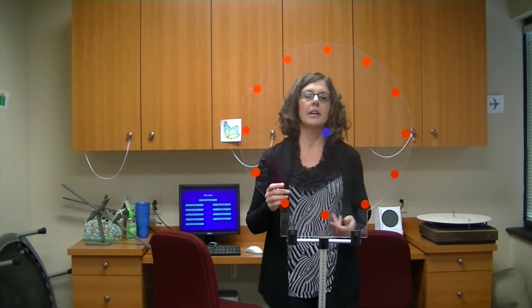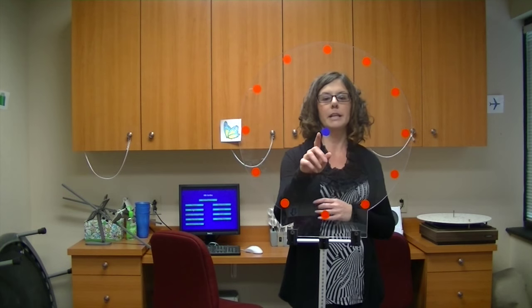And we usually have a metronome going, so they have a little bit of a consistent beat with this. But they do a process called look, ready, touch, return.